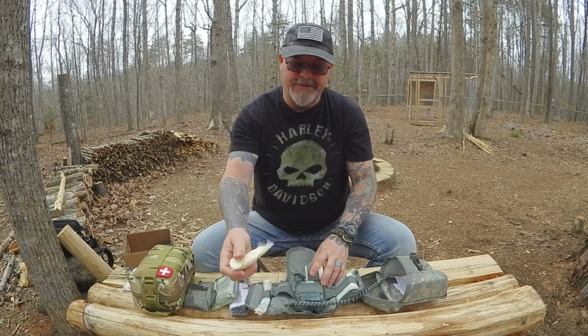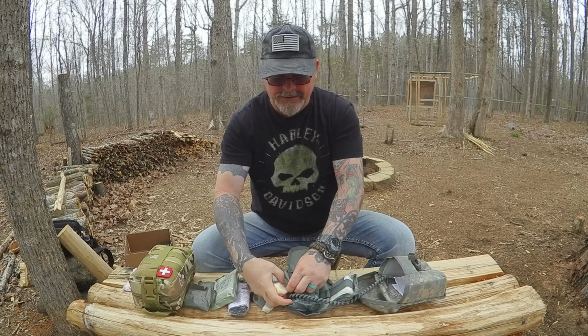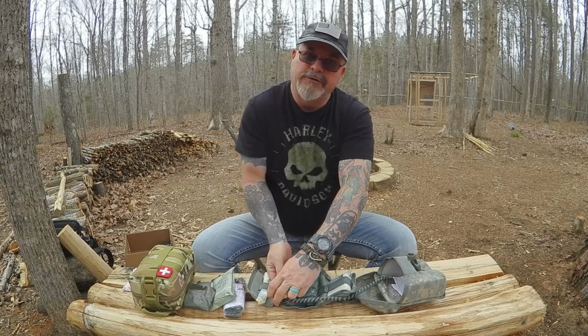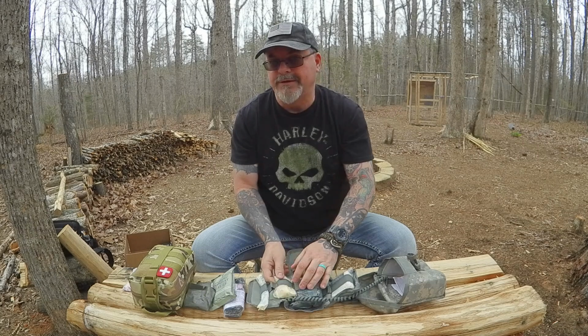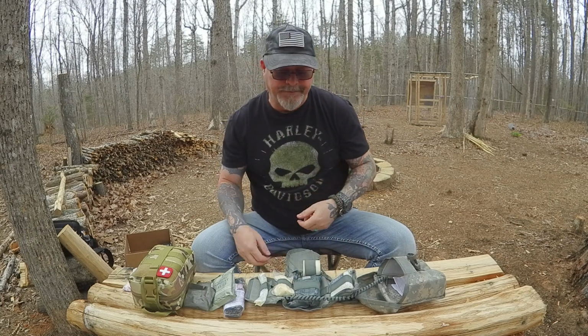Then there's gloves right here, a little pack of gloves. Those are military issue, so you're not getting junk all over you. But honestly, when you're triaging somebody out in a military environment, you're usually not thinking about gloves. You're usually thinking about stopping the bleeding because it's your buddy.